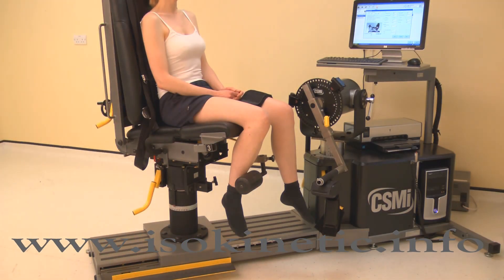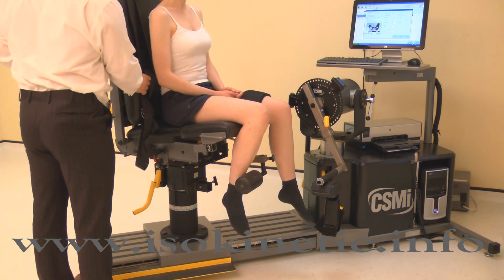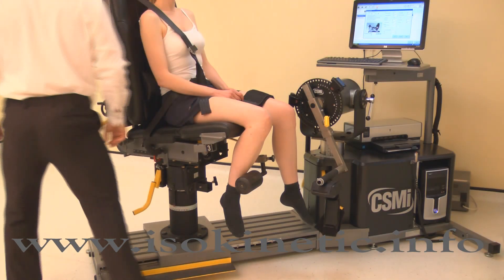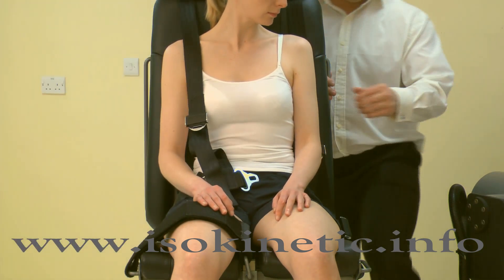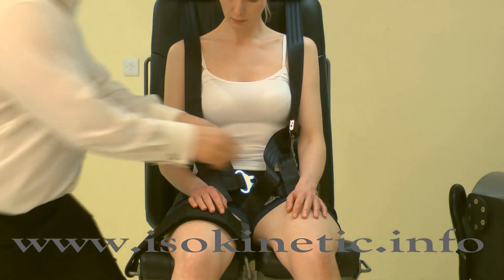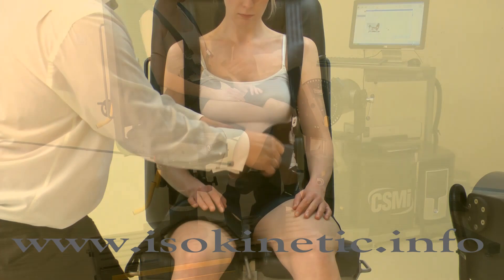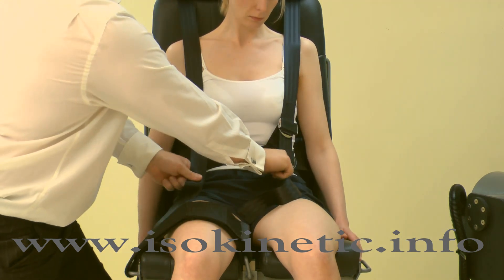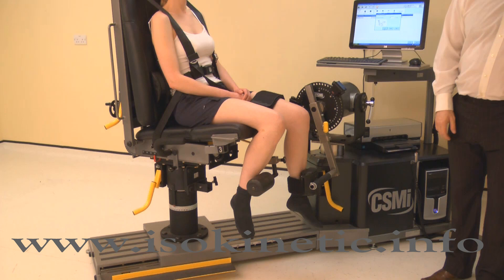The contralateral limb stabilizer, lumbar cushion and chest straps are all optional in knee testing. To use the lumbar cushion, position the subject first, then apply the lumbar cushion behind the subject and the lumbar lordosis. To use the chest straps, first place both arms through the loops, then clip the straps together using the clasp. Tighten the upper straps until the waist sections are above belt level, then tighten the waist straps keeping the clasp centrally on the waist. Note well: using the chest straps and contralateral limb stabilizer will affect the results obtained, so it is key to be consistent throughout and within tests.